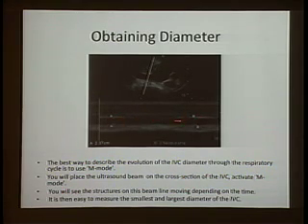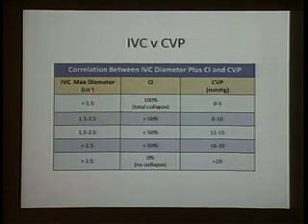If you see this one here, there's not much between inspiration and exhalation. This is a patient that, if you do your IVC measurement, is euvolemic, just by looking at the respiratory pattern. Okay? And look, if you have a very tiny IVC, you know you're dry, you're empty. Okay? Less than 1.5 is bad. Bigger than 2.5 centimeters, a dilated IVC. That's either a right-sided failure or an overloaded patient.